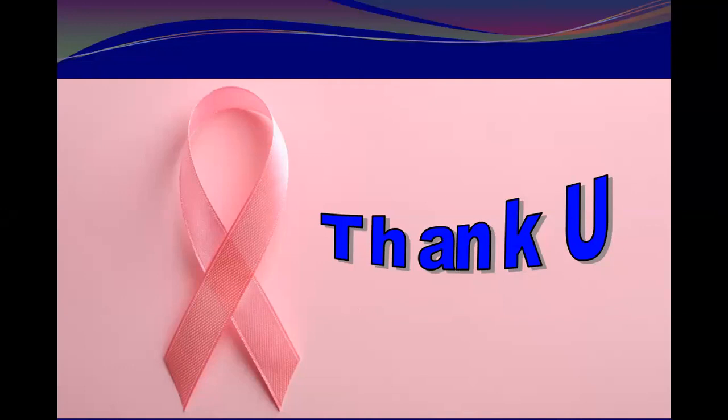I have shown you elastography also. Yes, elastography can give some help, but she would like to see the gray scale before going for elastography. So you can use this just to eliminate the artifact.